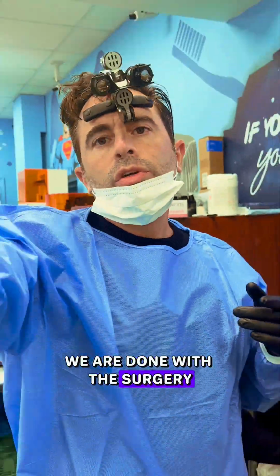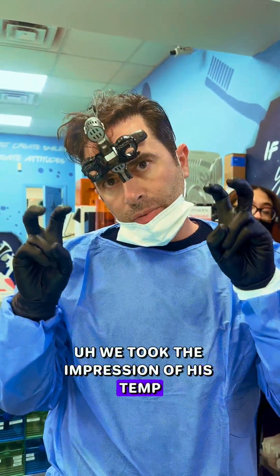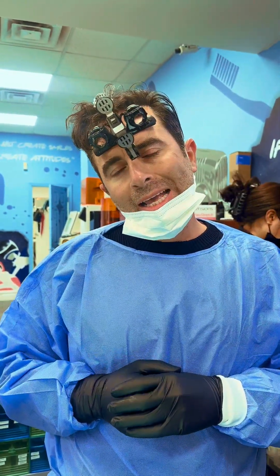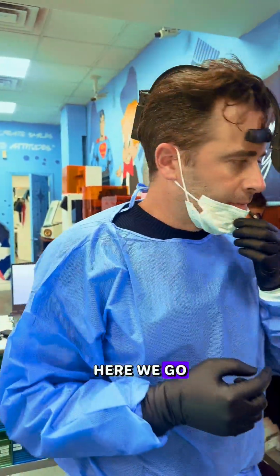We are done with the surgery. We took the impression of his temp, which is his original restoration. And now we're going to take it off and take the rest of the impression. Here we go.